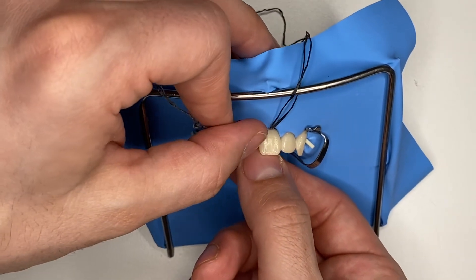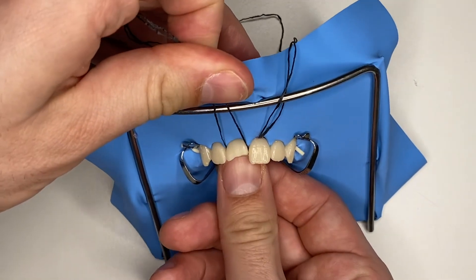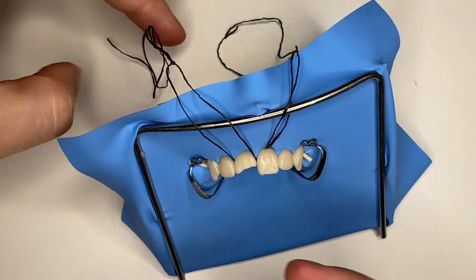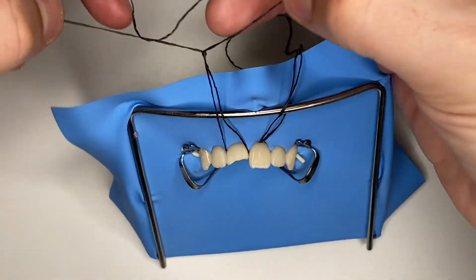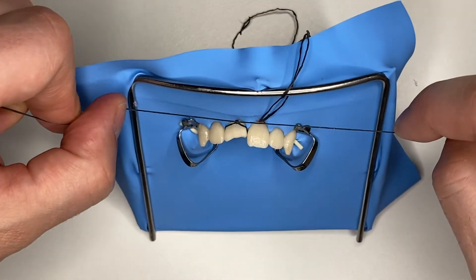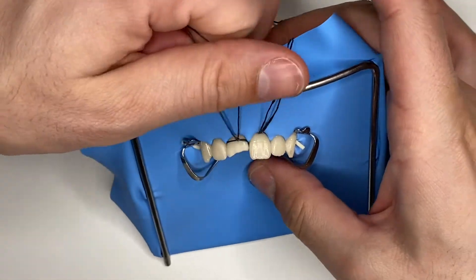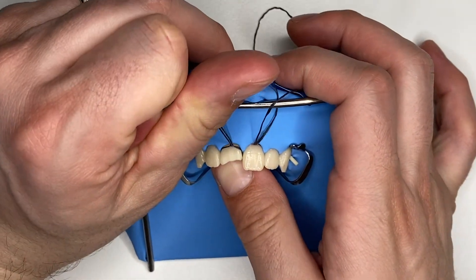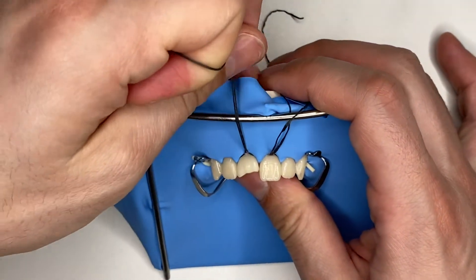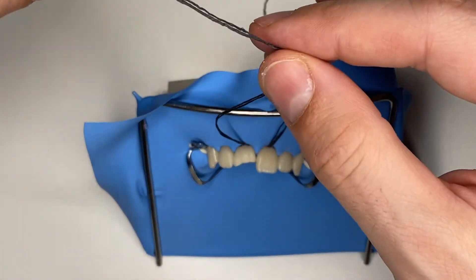Gently run through the distal, now through the mesial, tighten it on the palatal like this. Now you're going to gently tighten your knot, and once it's seated, push it towards the palatal even further like this, and tighten it even more.